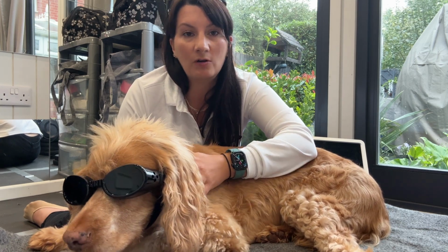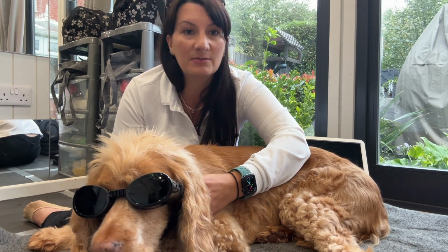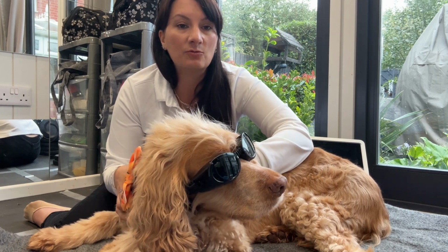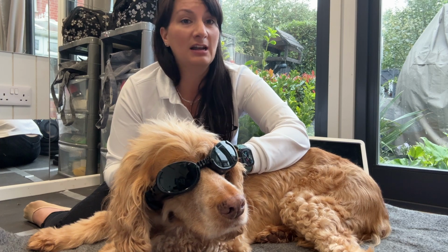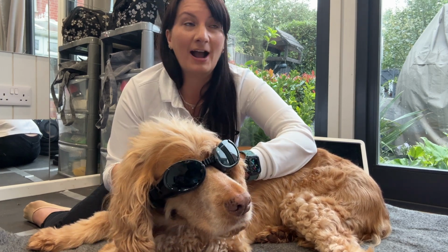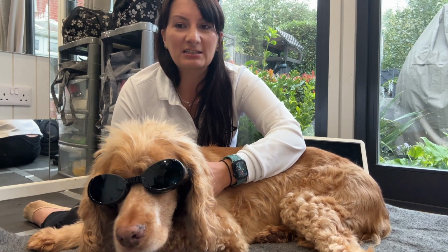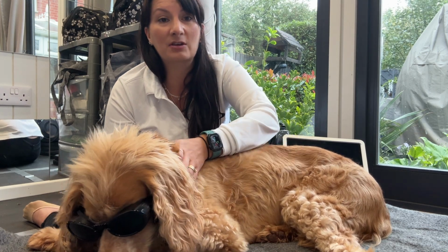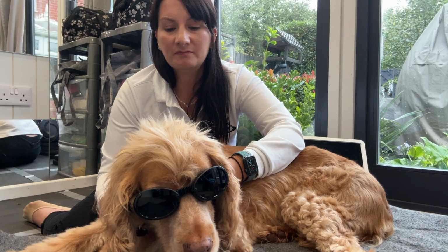Two questions I always ask before I even touch my laser is, first of all, what is my goal of the treatment? Why am I treating this patient? Have they got pain, inflammation, edema, swelling, tissue damage? What is it? It's not just because they're arthritic, so I'm going to laser them, because that's not actually telling me why or how the laser is actually going to help their condition. So really getting into, yes, they might have this condition, but I'm going to use my laser because this X problem needs to be solved.